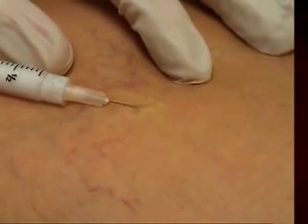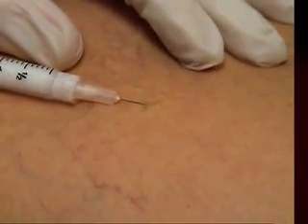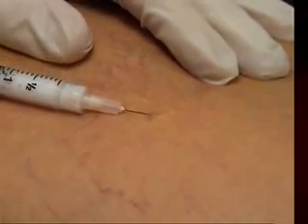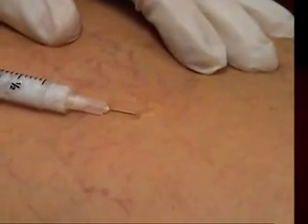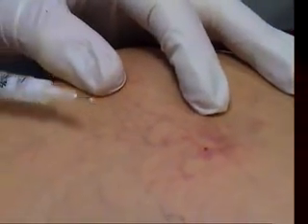Gentle pressure here. This is foam sotradecol, 0.1%. Now this goes in more slowly and does not reach quite as far as the regular sclerosing agent, but it hangs around for a long time. See how that hangs around? You can just see it refilling now centrally, but still a lot of this has not refilled. Very often, actually, I squeezed it. You notice I squeezed it right there and it came back more quickly.